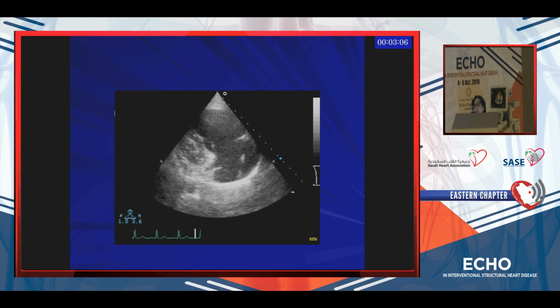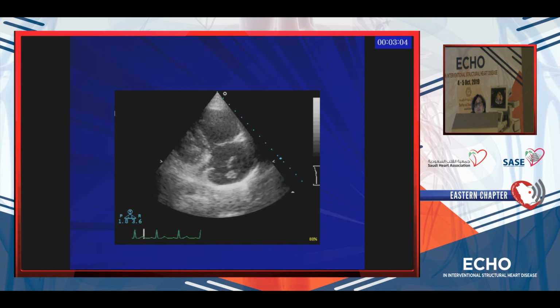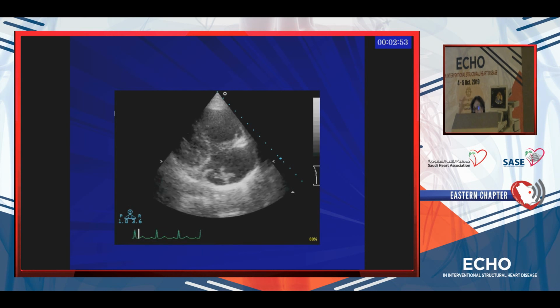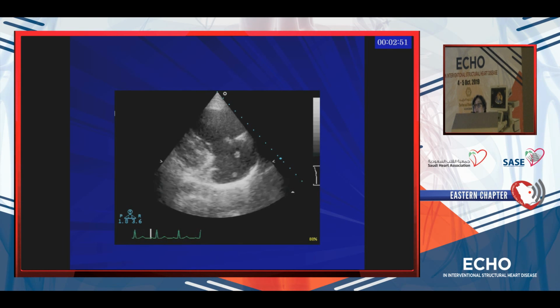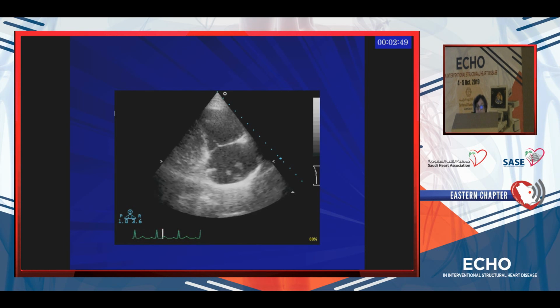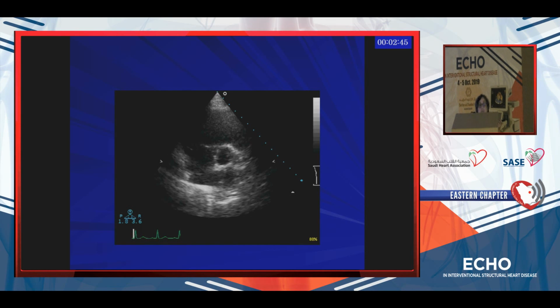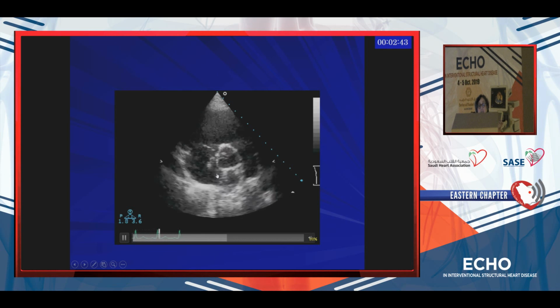Everybody would tell you that this is most probably a thrombus. This lady hardly moved at home, but people were saying, well, she has a cervical cancer, and this could be cervical metastasis. Think of the things which are more common. And they started arguing, shall we give her TPA or not? And the TPA people won, but let me show you what this lady had.